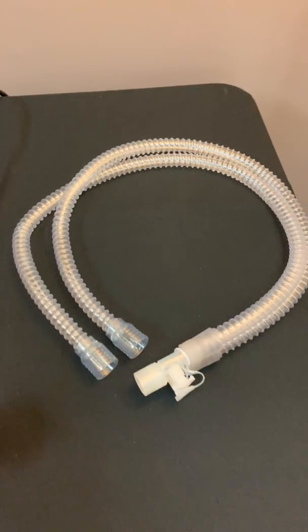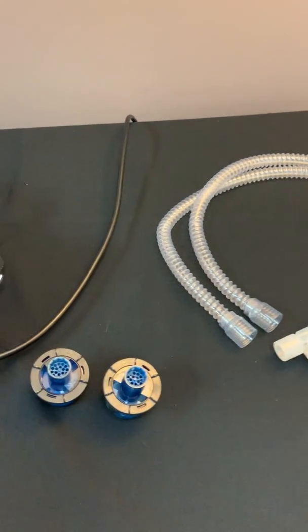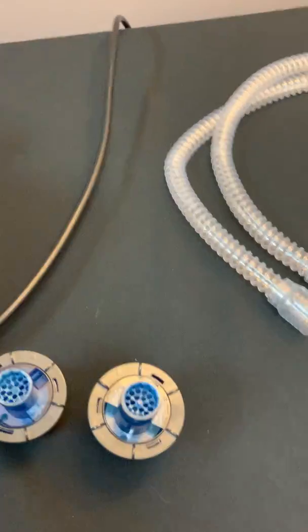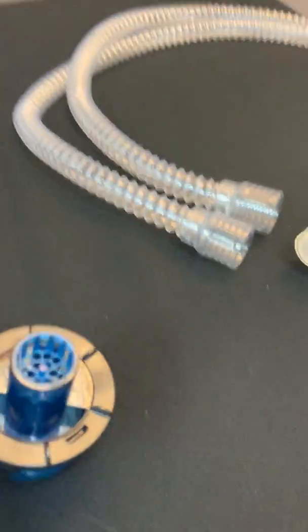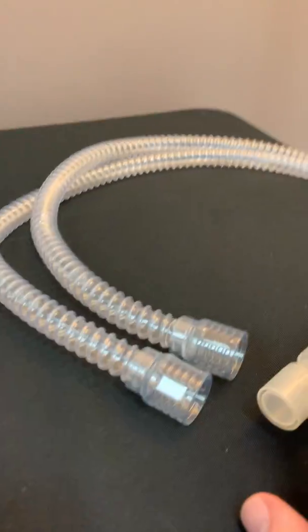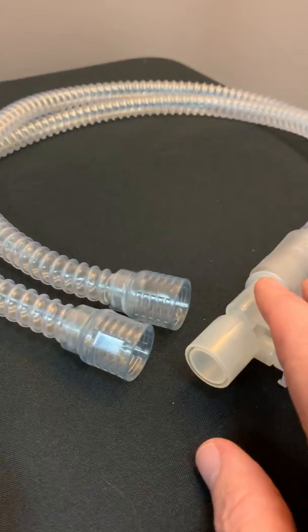So what you're going to need is a couple of things. You'll need a dual limb circuit and you're going to need one of these exhalation valves. So the Vivo 65 does not require a proprietary circuit.